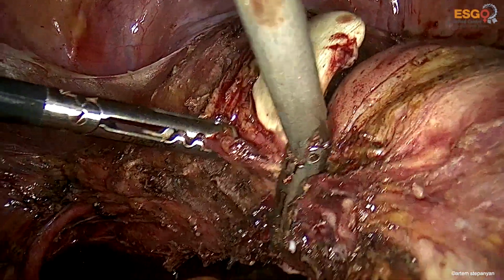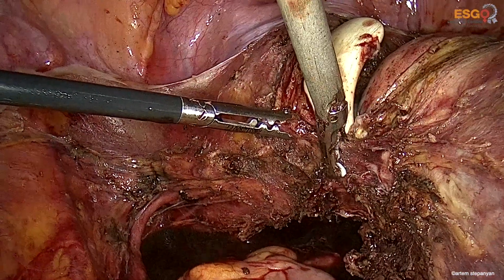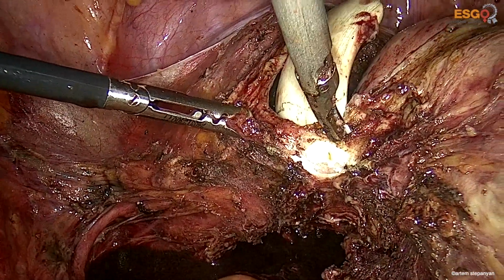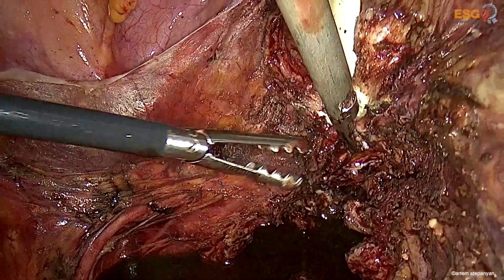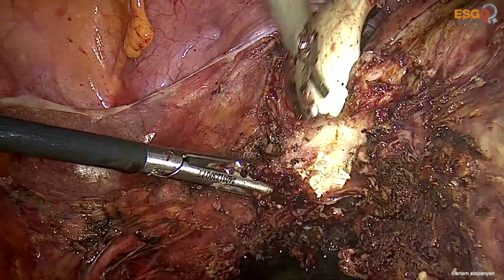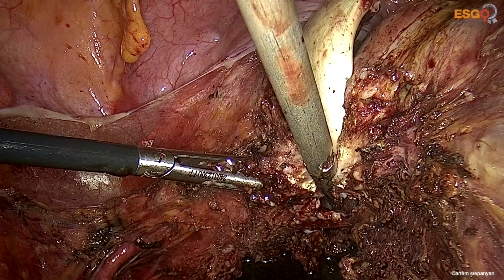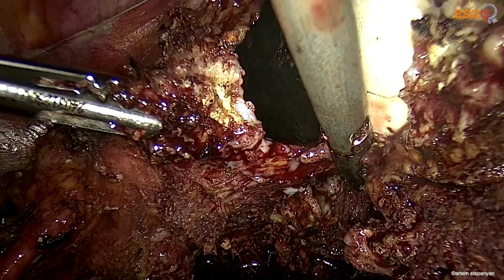Then we move to the left side again. And the rest part of the vagina is finally cut.